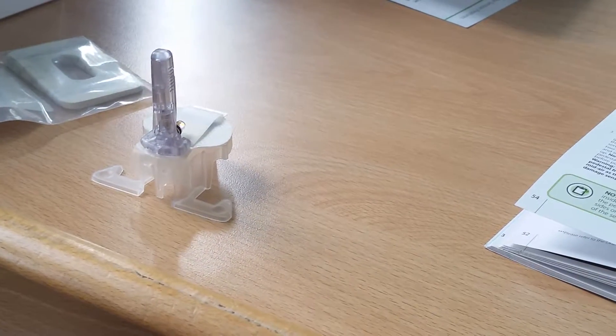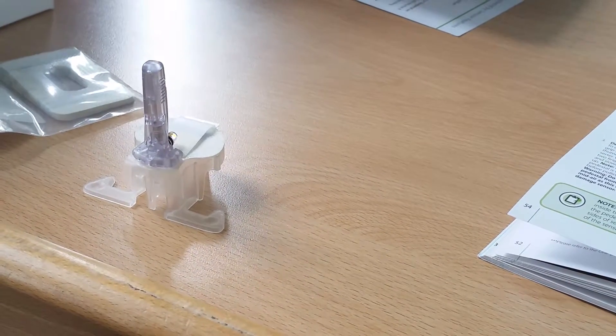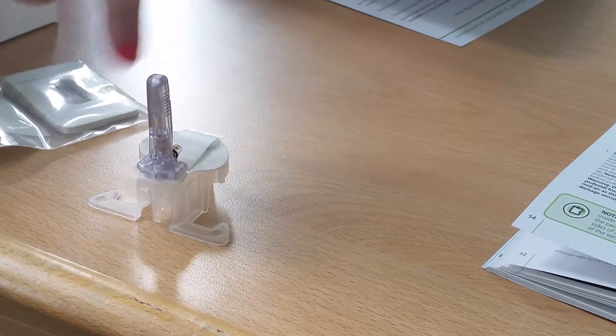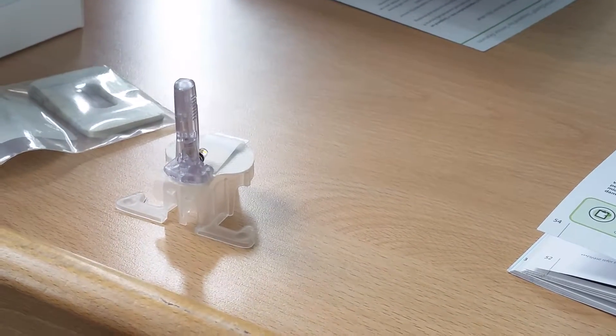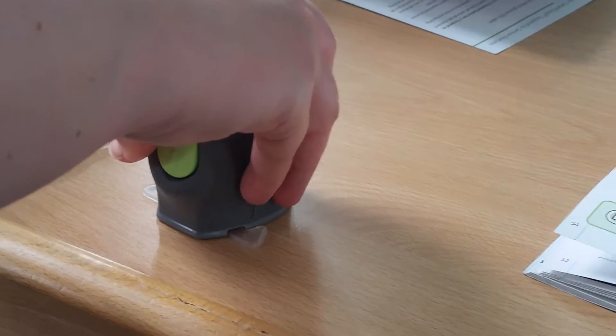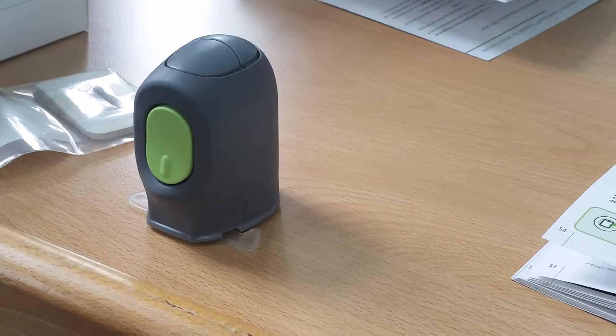This device is going to go over the top of there, so you can see where the hole is. Some people ask which way around — it's the rounded bit to the rounded bit. You're just going to push it over the top so it sits flush with the table.